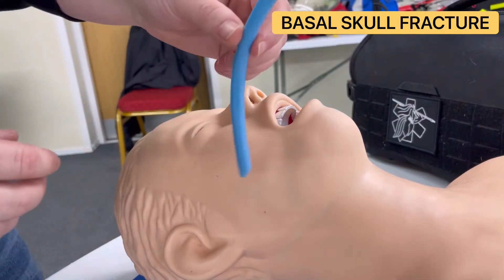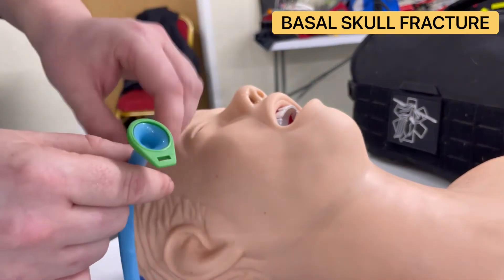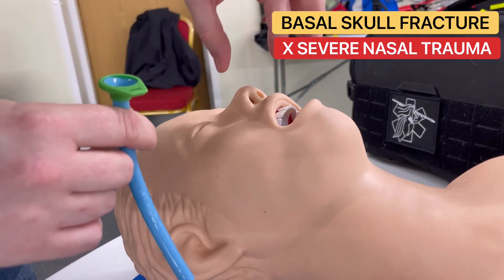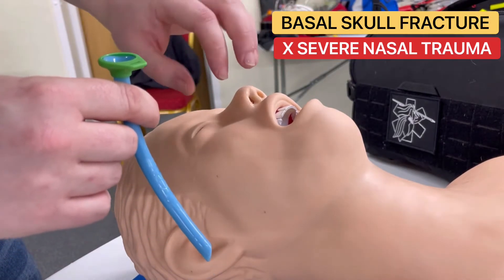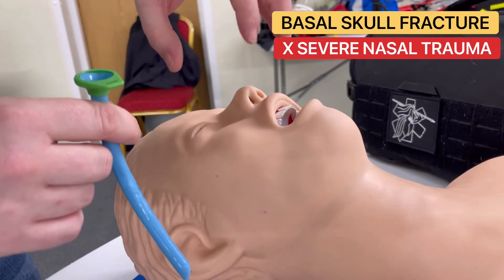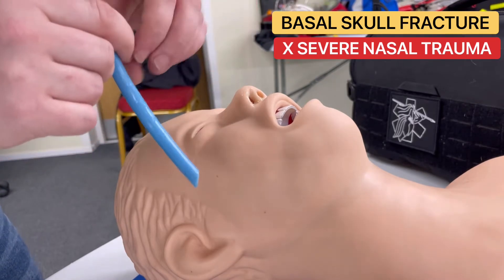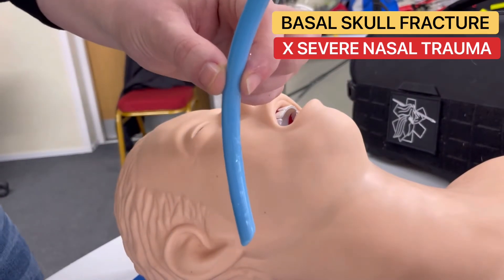The only true contraindication for this device is significant nasal trauma where you can't see where you're going to be inserting it. If there's massive trauma around the nose and you physically can't see a hole to put it in, then we're obviously not going to insert it. But whilst the nostril is still identifiable, these are okay to be inserted.